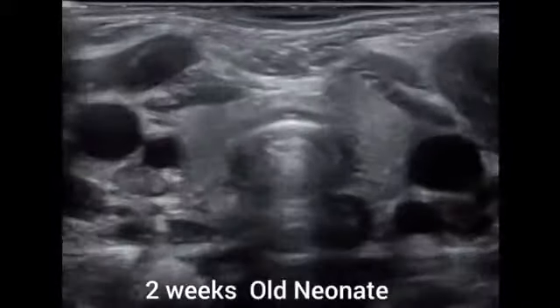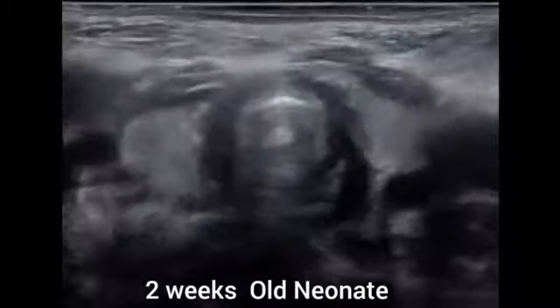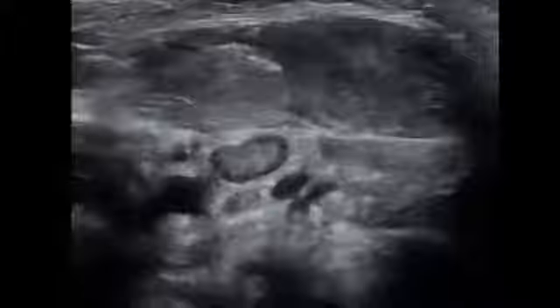Now here's another interesting case, not uncommonly seen. This is a 2 weeks old neonate who had undergone a forceps delivery and has presented with torticollis. Now when we see this picture, of course, we can see here the thyroid gland, and on the left side, as we start scanning, we can see a focal area of heterogeneity within the sternocleidomastoid muscle. This muscle is bulky and is showing altered and reduced echoes.